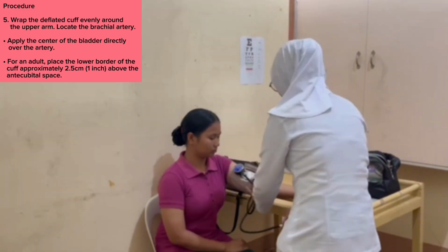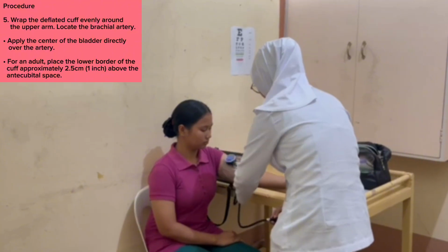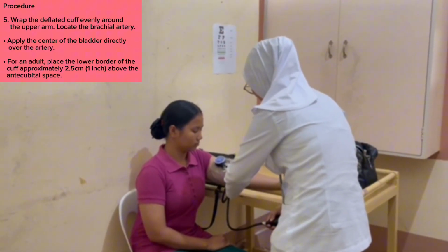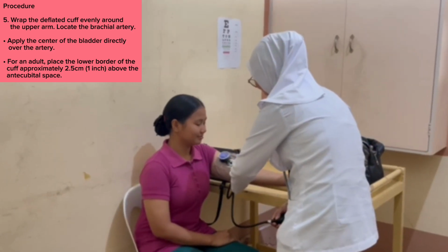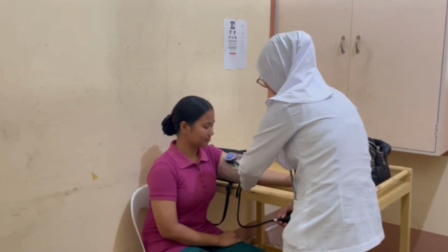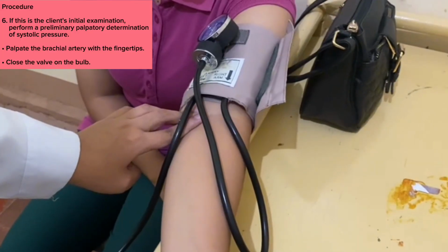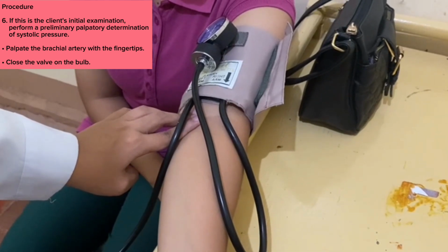Locate the brachial artery. Apply the center of the bladder directly over the artery. For an adult, place the lower border of the cuff approximately 2.5 cm or 1 inch above the antecubital space. Number 6, if this is the client's initial examination, perform a preliminary palpatory determination of the systolic pressure.